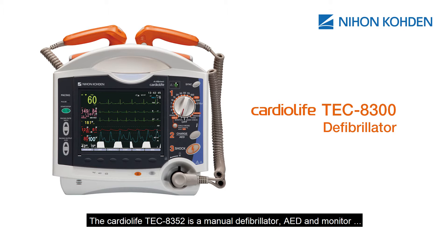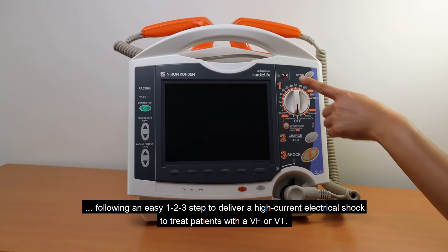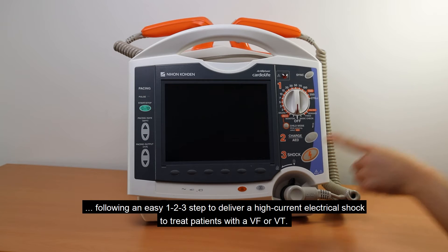The Cardiolife TEC-8352 is a manual defibrillator, AED, and monitor, following an easy 1-2-3 step to deliver a high-current electrical shock to treat patients with VF or VT.